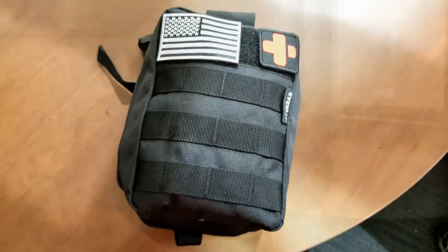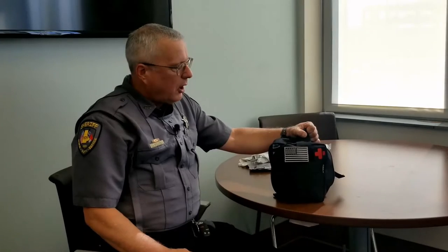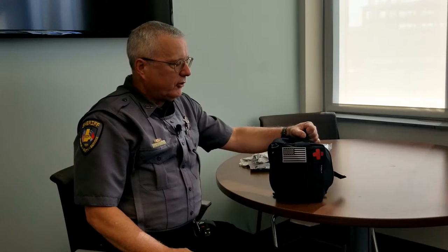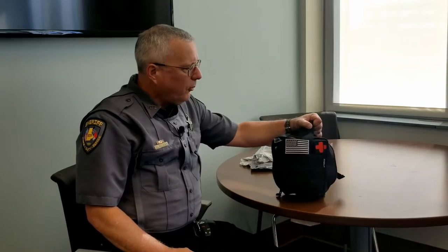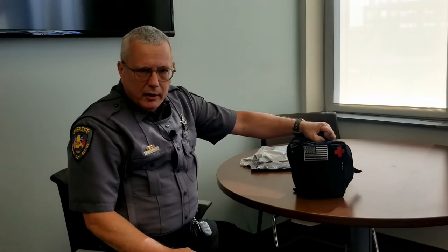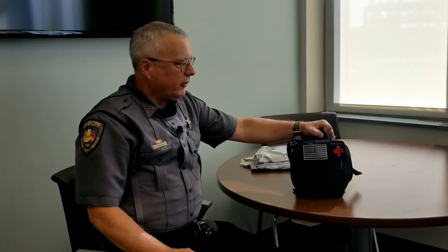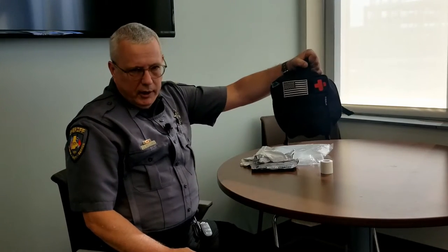Within the next few weeks, the Durham Sheriff's Office is going to be deploying new first aid kits, new trauma kits to several divisions within the agency. Right now the plan is to send these out to the patrol division and maybe several other units as well. We wanted to go over this and make sure everybody knows exactly what's in this and how to use the components of this kit. This is what the kit looks like.